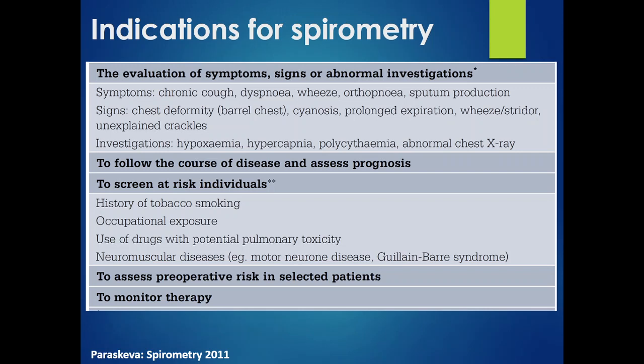Also, spirometry and PFTs are helpful for pre-operative risk assessment in patients who specifically will undergo lung surgery like lobectomy, pneumonectomy, etc. Also, spirometry and PFTs are an invaluable tool to assess the response to medical interventions and treatments in asthma, COPD, interstitial lung disease like sarcoidosis, etc.